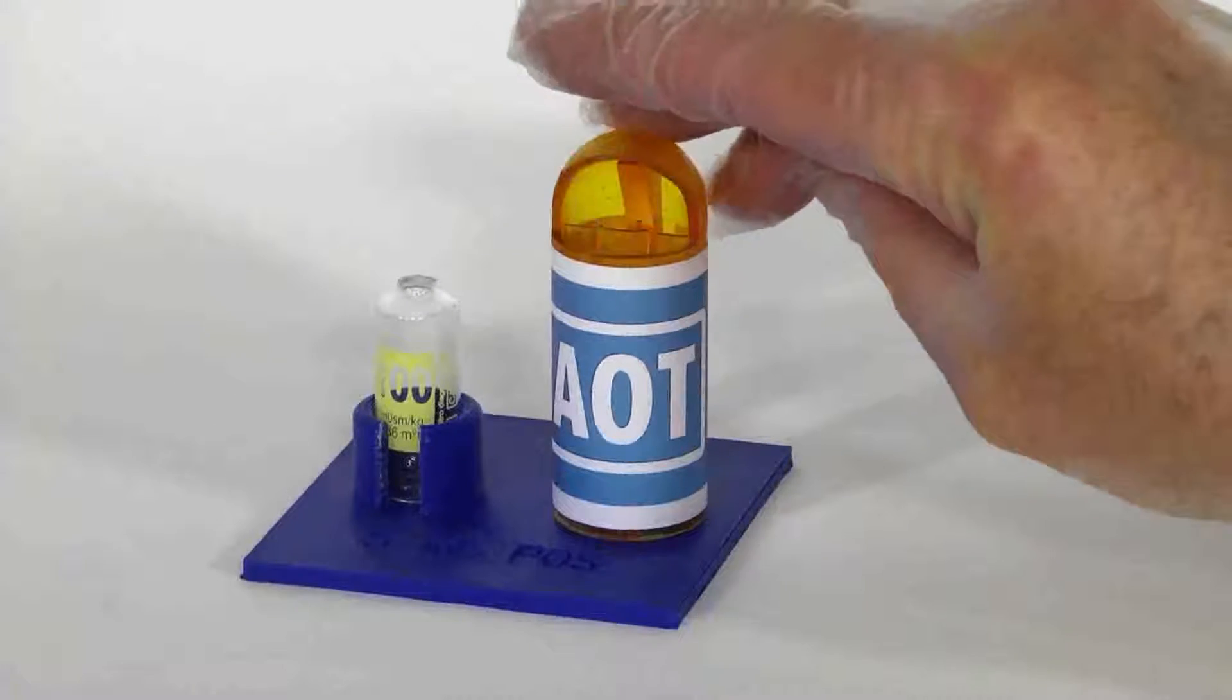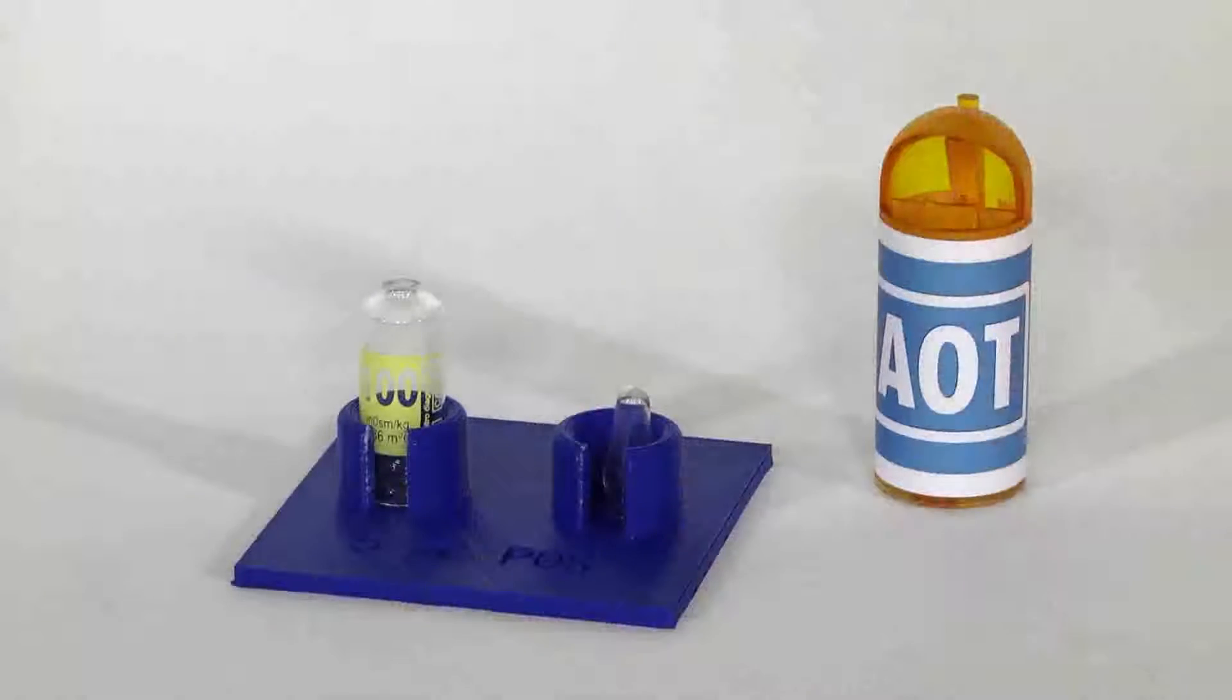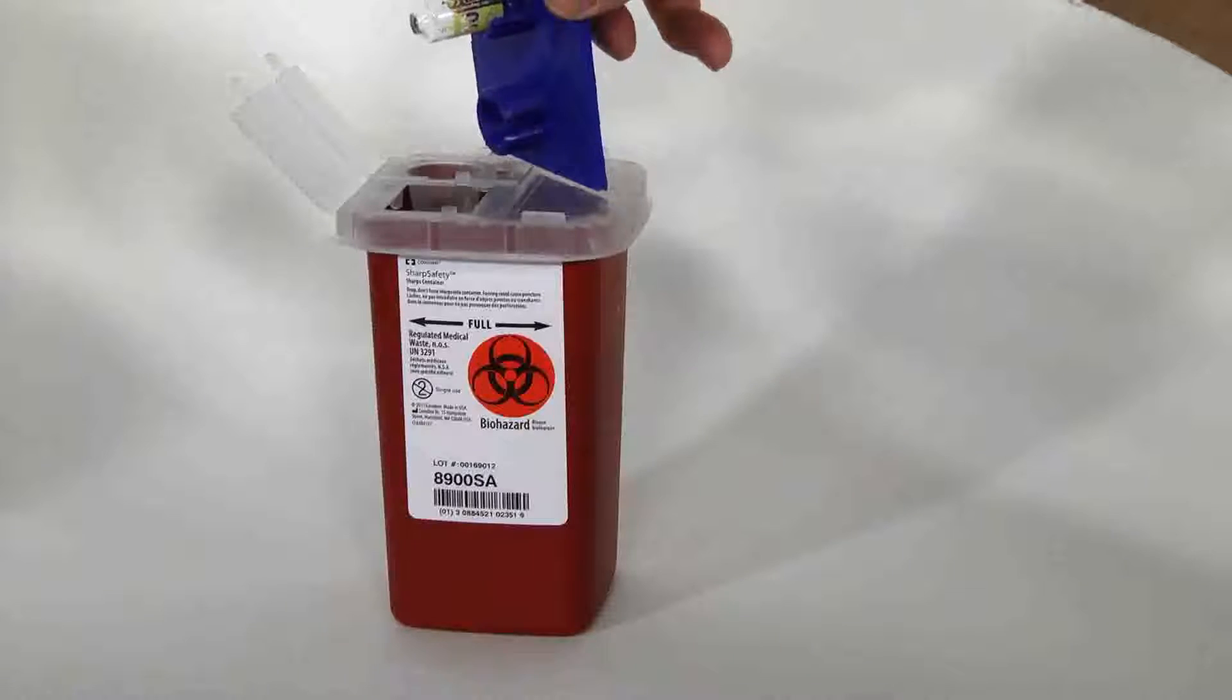Lift the opener straight up and the neck will be captured in the base. You can now dispose of both the body and the neck by picking up the base and inverting it above a sharps container.